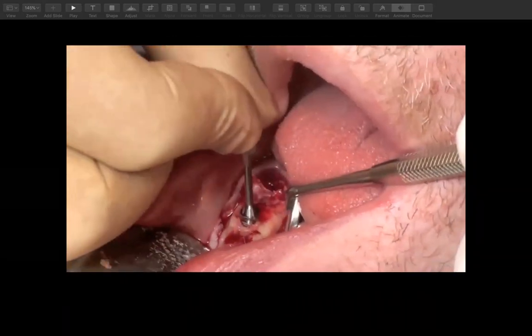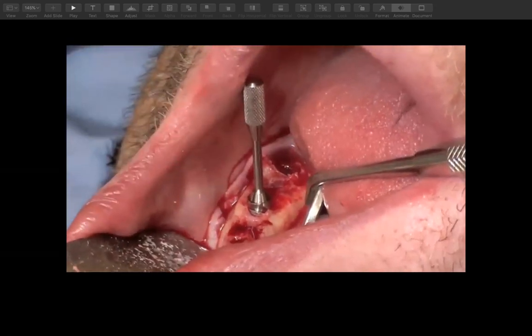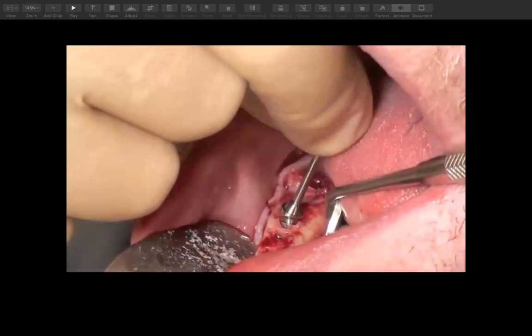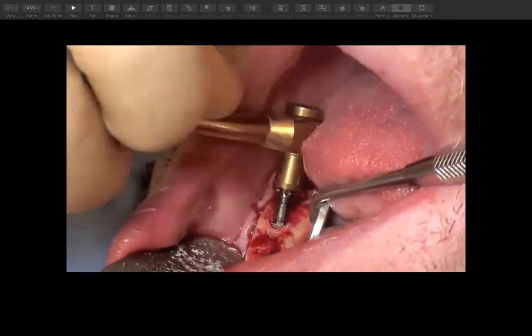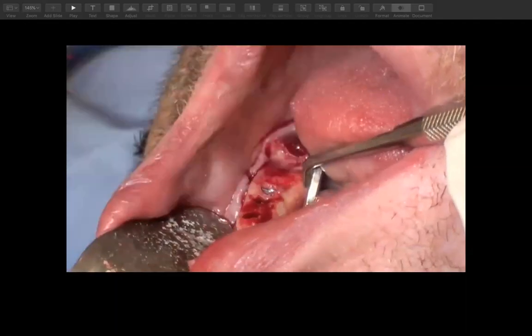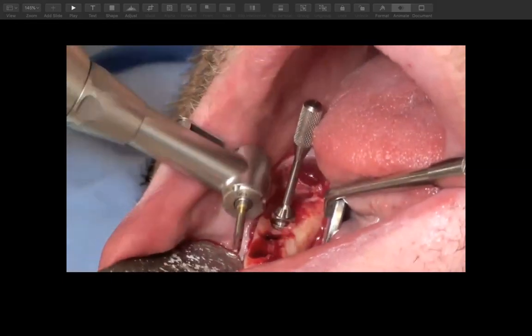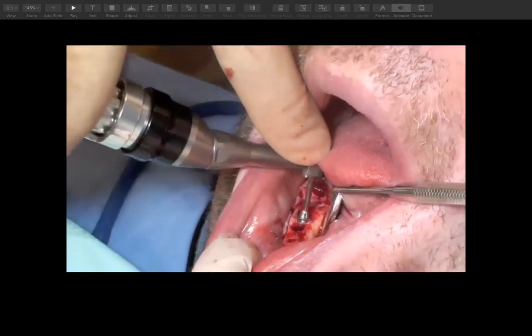This is just a quick little video here of a doctor trying to position the multi-unit abutment. They might have put on the clear surgical dupe in this video. But they also possibly have to trephine around that implant to get rid of any bone that might be in the way, keeping that multi-unit abutment seated. You can see here the doctor's turning that implant a little bit because I believe this is a Nobel Replace trilobe, and I think they're trying to get that to line up a little better than what they previously had. And once that's seated, then they'll use a torque driver to screw that down, okay?